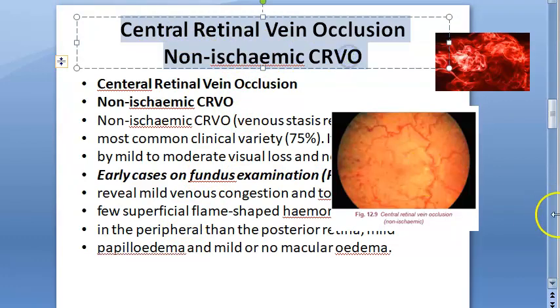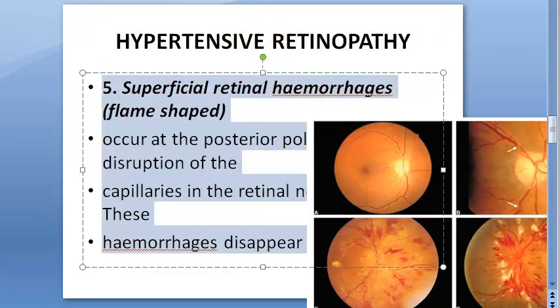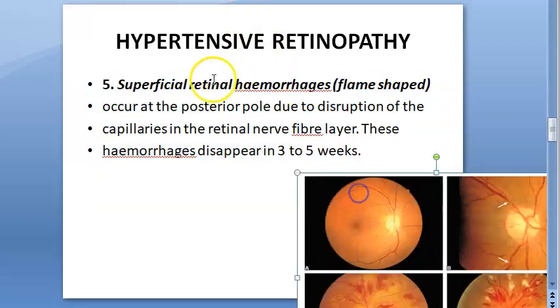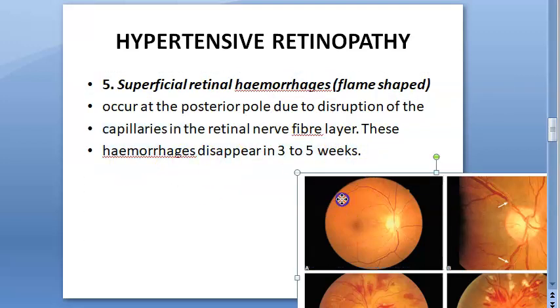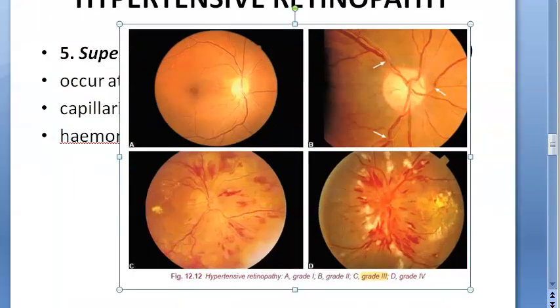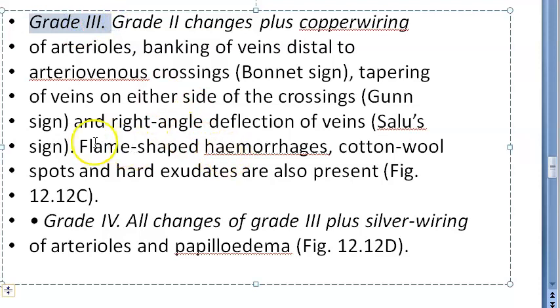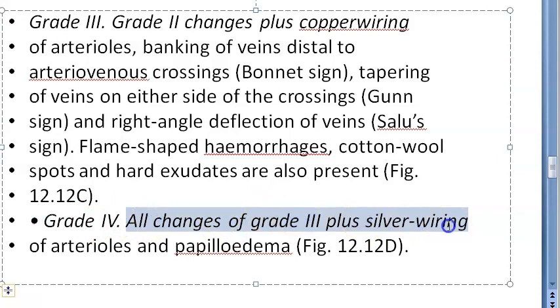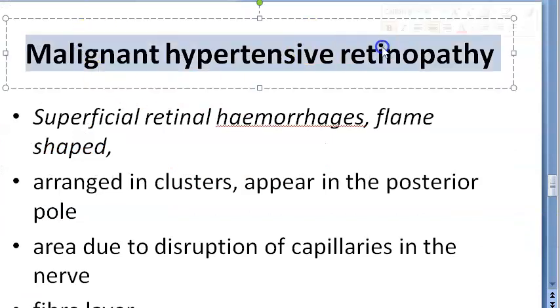Another cause is hypertensive retinopathy. There are superficial flame-shaped hemorrhages in the posterior pole, due to disruption of capillaries in the retinal nerve fiber layer. These hemorrhages can also disappear. Specifically, in grade 3 hypertensive retinopathy you can see flame-shaped hemorrhages, and in grade 4 you also have the same hemorrhages along with silver wiring and papilledema.